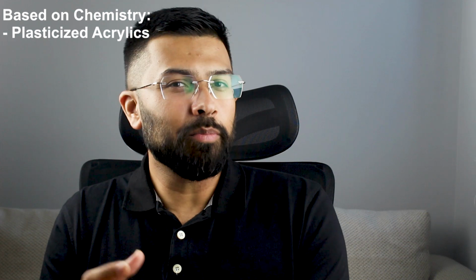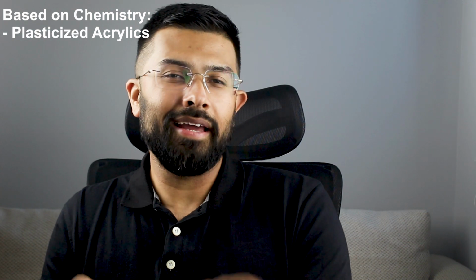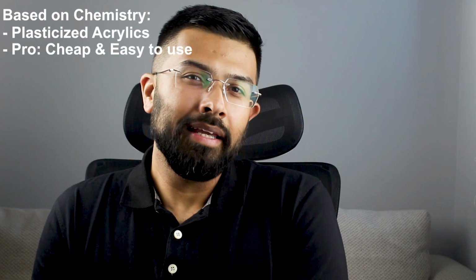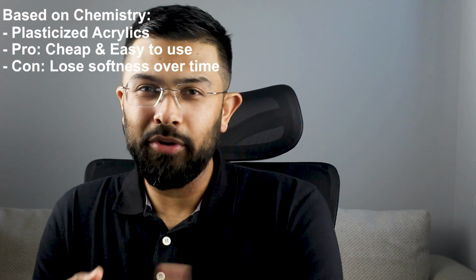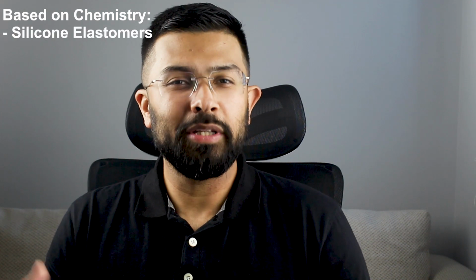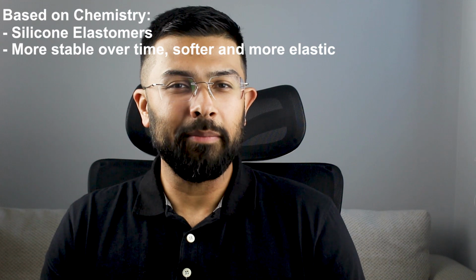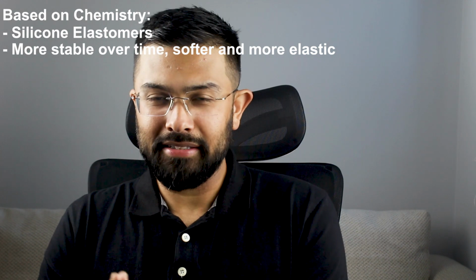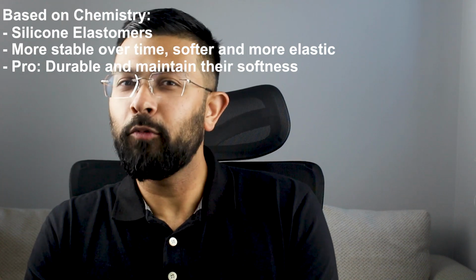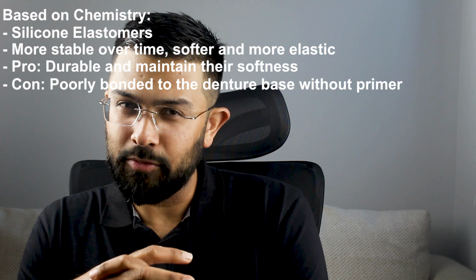So another way to classify the soft liners would be based on chemistry. There are plasticized acrylics similar to polymethyl methacrylate, but with added plasticizers to keep them soft. A pro of this would be they're cheap and easy to use, but a con would be that they lose softness over time as plasticizer leaches out. Now, based on chemistry, another type would be silicone elastomers. They're more stable over time and they're softer and more elastic. A pro would be they're durable, they maintain their softness. A con would be that they're poorly bonded to the denture base without primer.